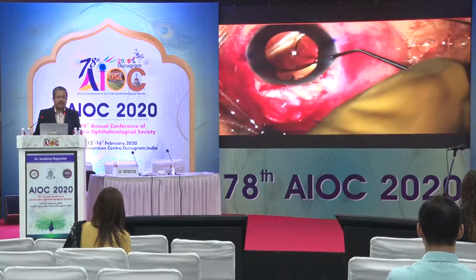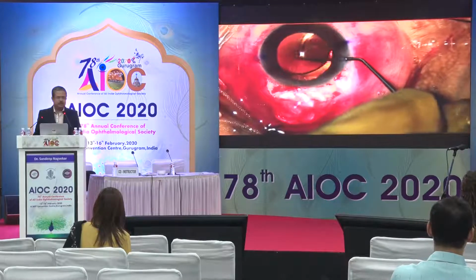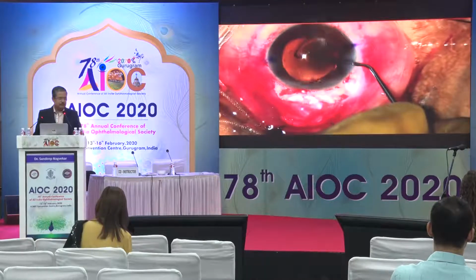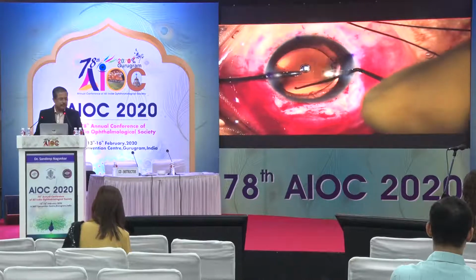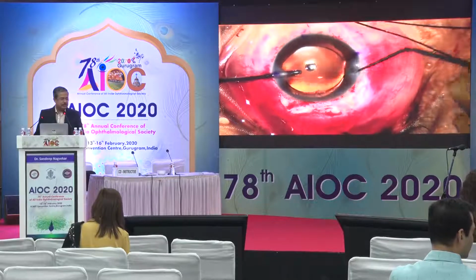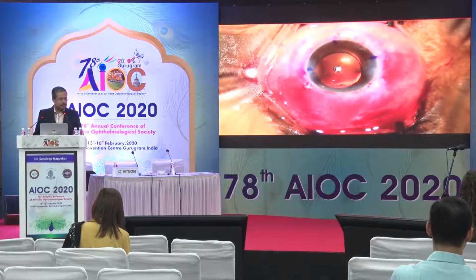So that's all that I'd like to basically tell you. Most of these things require a lot of patience. You should take a lot of time over these hard cataracts. Don't keep them for when you're very tight for time. You should do these cases slowly, gently, and I think we can all have a very good result. This was literally the end of this procedure, and the case was closed with coaptation with the help of cautery.